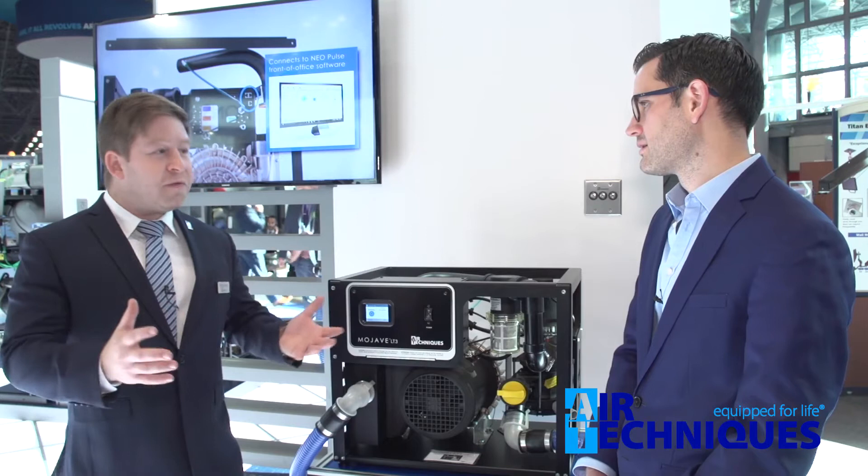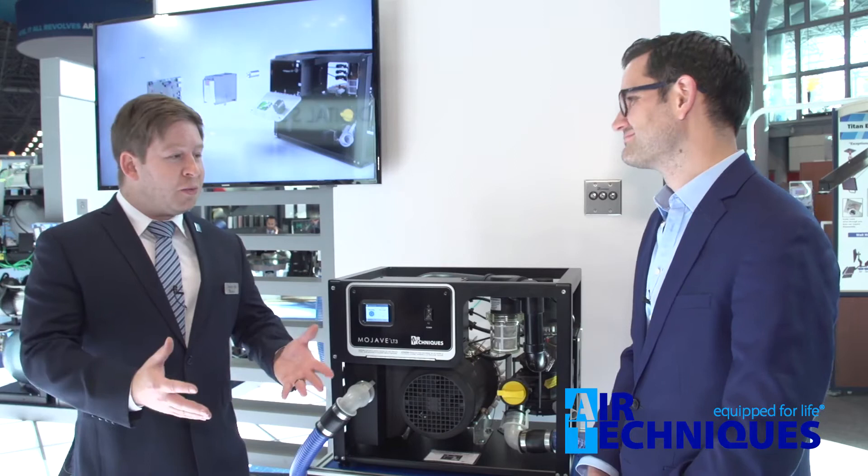Traditionally, these units would operate at one single power level regardless of how many suction units are on. A typical liquid ring pump turns on all day long and uses the same amount of water and electricity regardless of whether you're using the HVEs or not — so you're paying for all that electricity and water even when you're not actually using the vacuum.